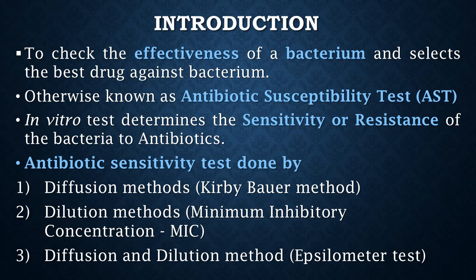There are different types of antibiotics. Each type is only effective against certain bacteria. Antibiotic sensitivity test can help us find out which antibiotic will be most effective in treating an infection. This test can also be helpful in finding a treatment for antibiotic resistant infection. It happens when a standard antibiotic becomes less effective or ineffective against certain bacteria. Antibiotic resistance can turn once easily treatable diseases into serious, even life-threatening illness.